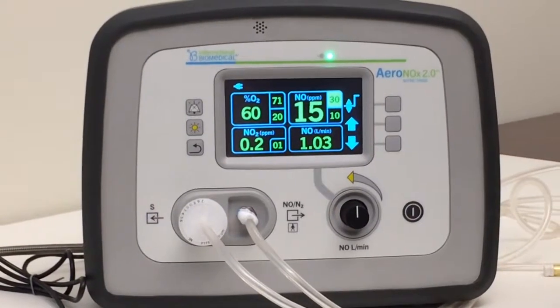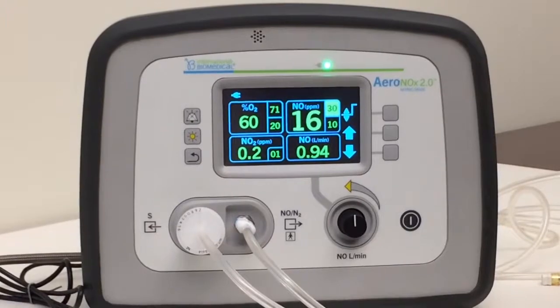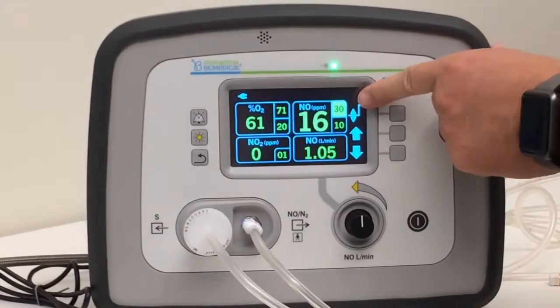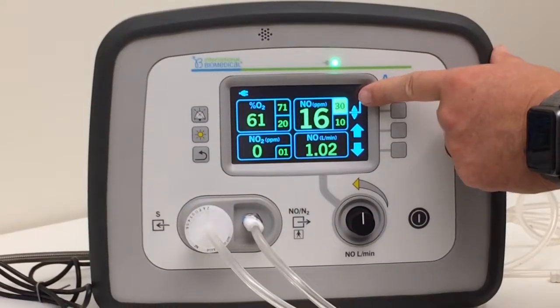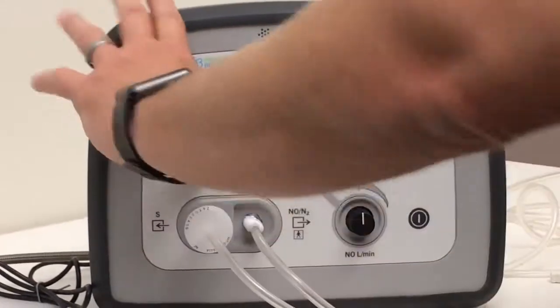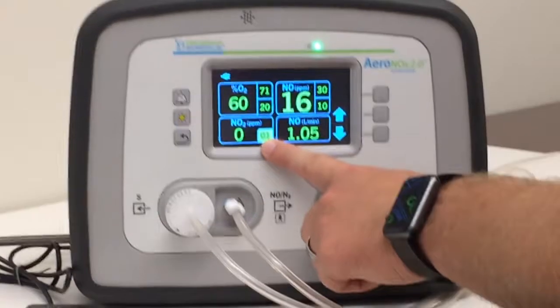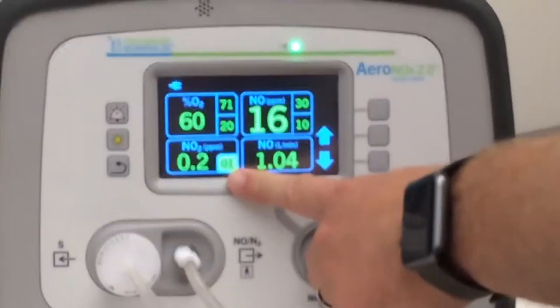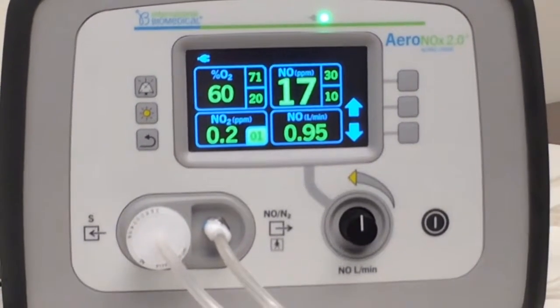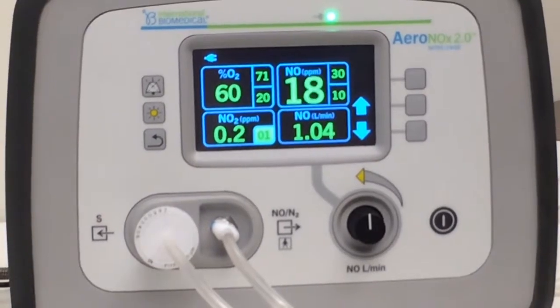Once you fall back within that range, it'll de-latch the alarm and it'll start the nitric again — but it does turn the nitric off; it doesn't let it spike much higher than the high limit alarm. For the NO2, the alarm you set is the high limit alarm, and if it gets one part per million above the high limit alarm, then it shuts the nitric off. Those are two important safety mechanisms to know when you're teaching the Aranox.